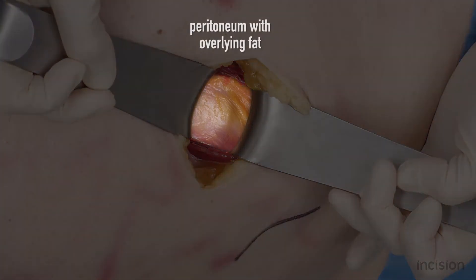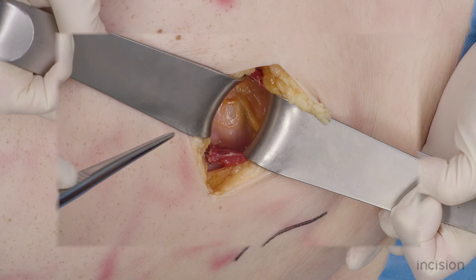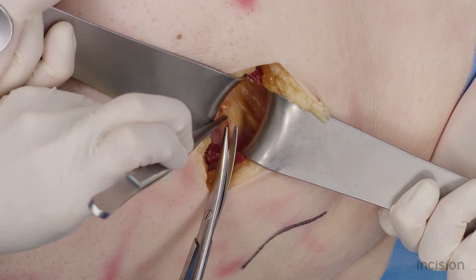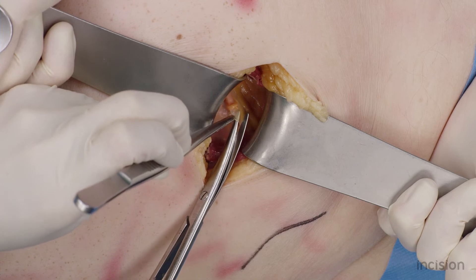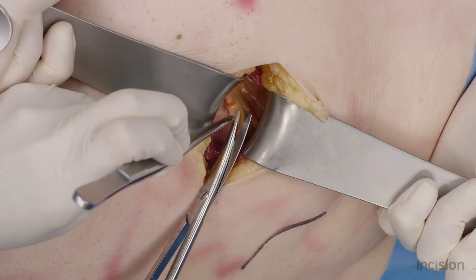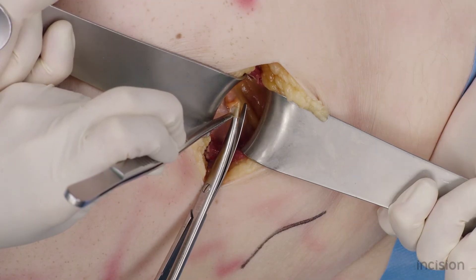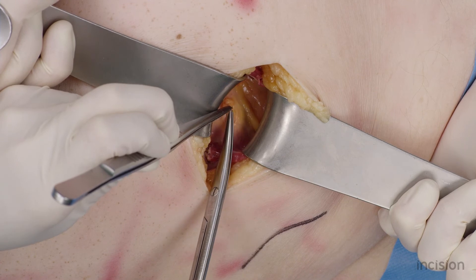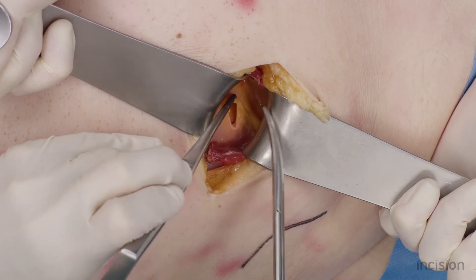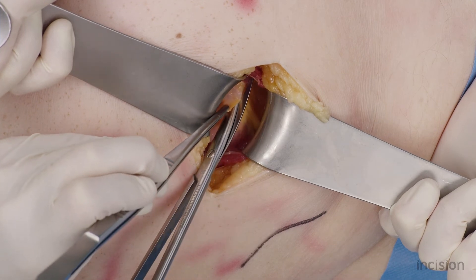The peritoneum with overlying peritoneal fat is now exposed. Lift the peritoneum with forceps and postpone cutting the peritoneum until the silver sign is seen. Here you see the silver sign as a reflection of the scissor blade through the peritoneum. This maneuver can also be done with a finger, reducing the risk of perforating intraperitoneal organs.